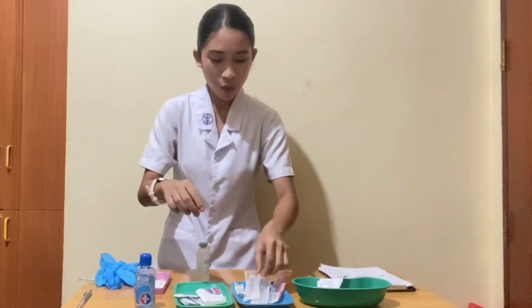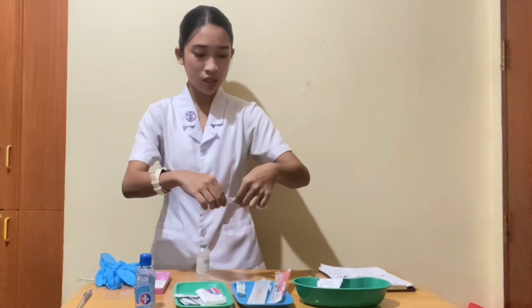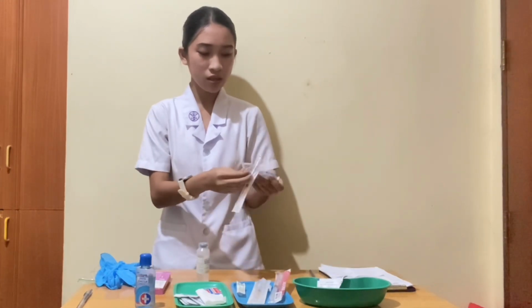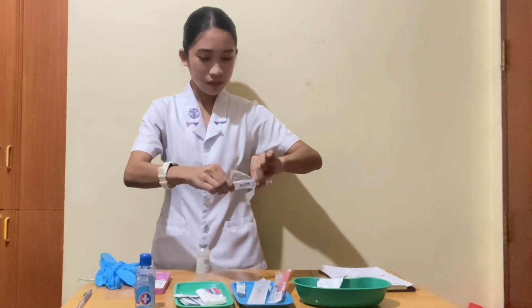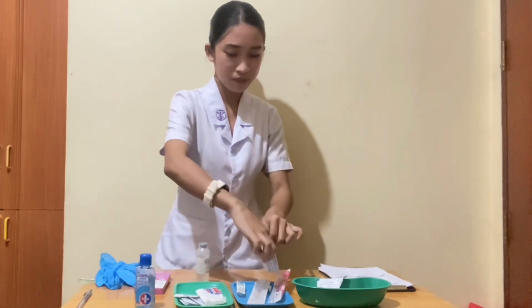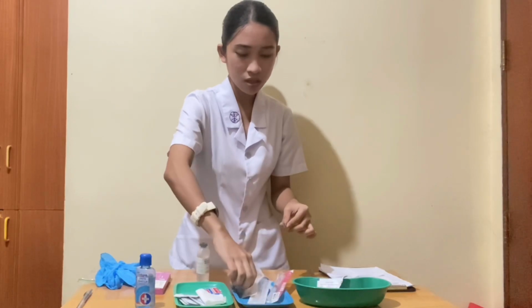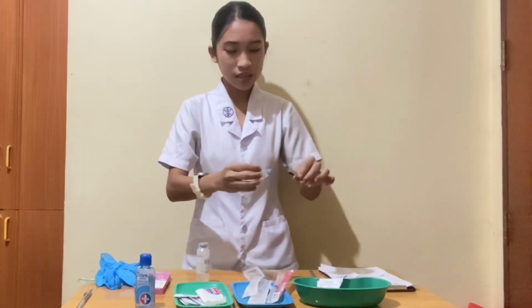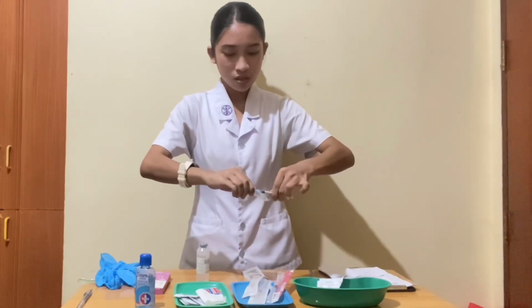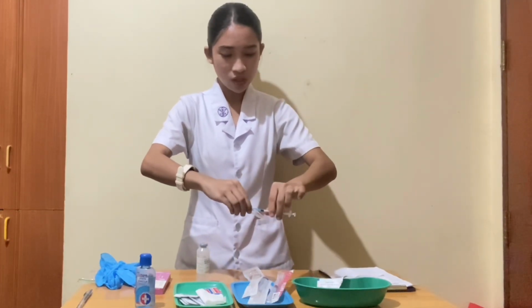So I'm just going to get this 1 cc syringe by opening it. Detach the regular needle, and then open this aspirating needle. Then attach this aspirating needle to this 1 cc syringe.